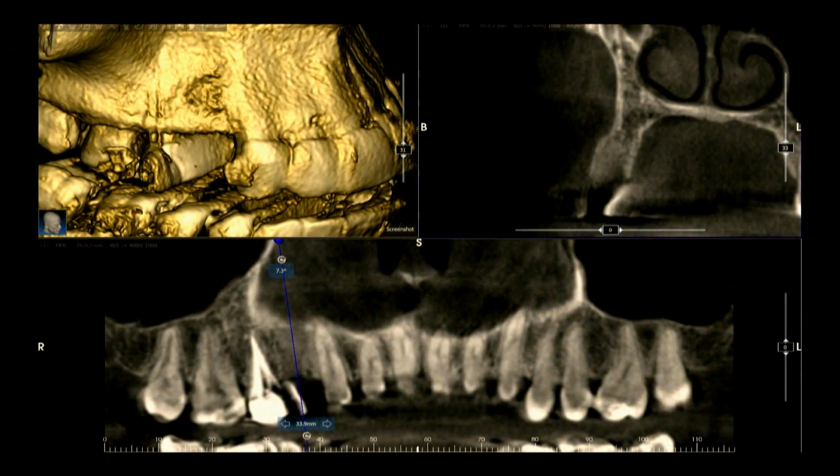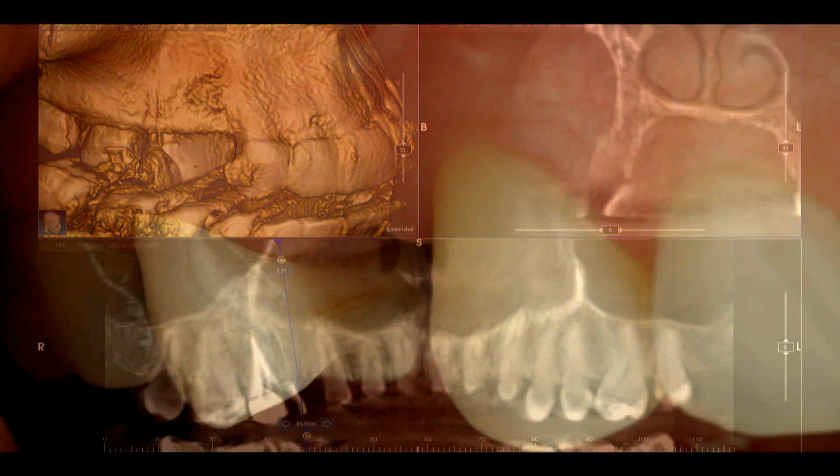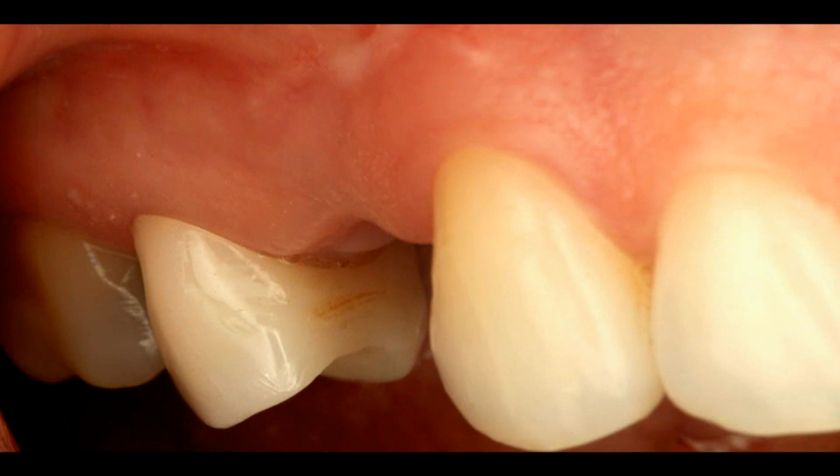And then she came back in, we took our CT scan. You can see, again, just very similar to John's case, complete bone fill. But you can see I really packed bone into that buccal occlusal line angle and have it being contained by that BioXclude barrier membrane. And you can see how the site healed.